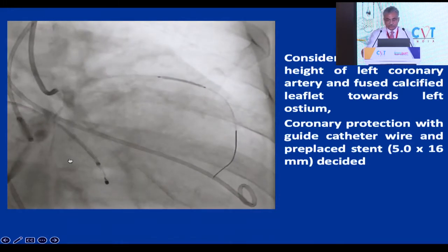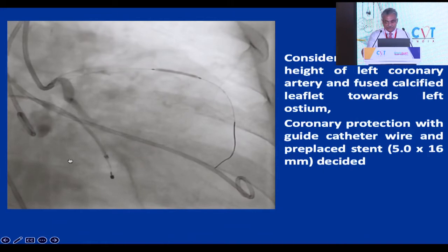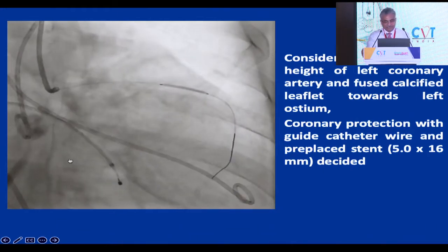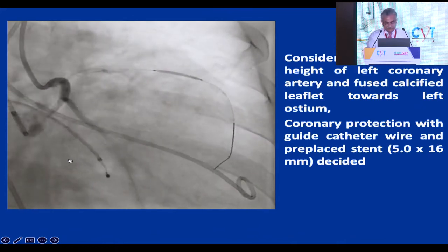So considering the low coronary height and the fused calcified leaflet toward the left ostium, we decided on coronary protection with a guide catheter, wire and a pre-placed 5x16 stent. All were going fine, there was no problem.